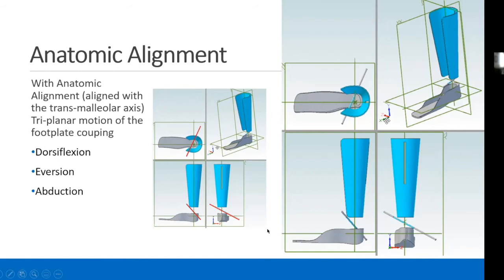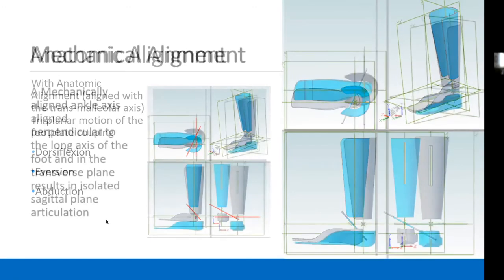But you'll also get a movement which lacks the compensations of what the foot would normally do if it was free to move. The mid-tarsus and the forefoot would be free to move, which it is not in the orthosis. Those joints are relatively constrained, and so we're trying to distill out all of that combined motion into a single axis, into a single joint motion that may or may not be beneficial up the kinetic chain to have a foot plate or a pressure moving that way on a tibia as the patient walks.